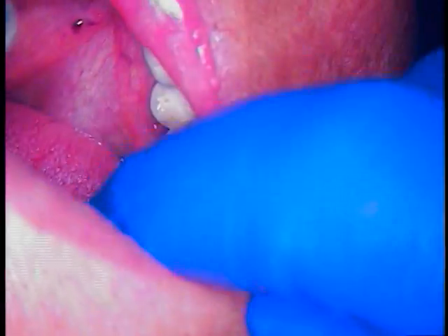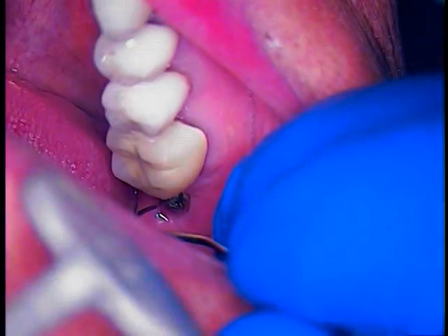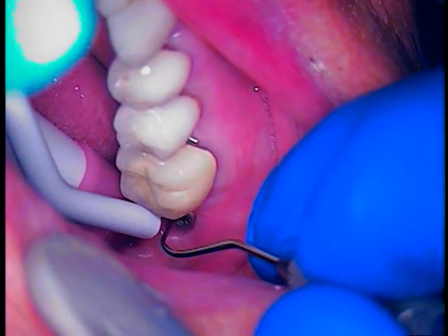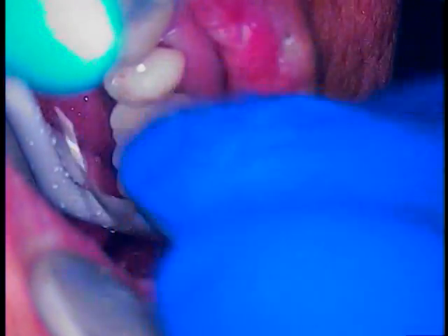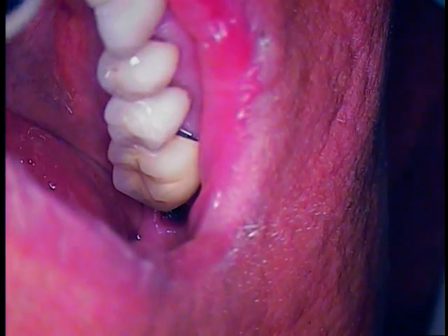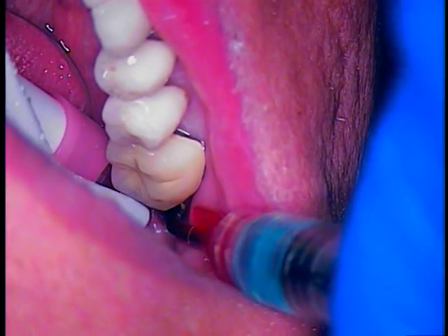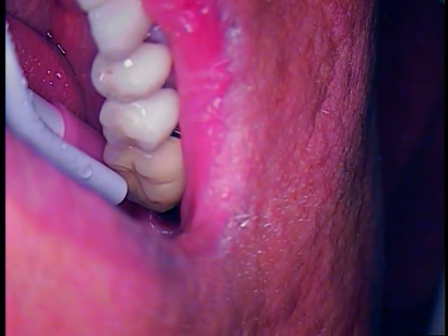Let's have a look. I'm going to put him in a little better position, using plenty of arm support and wrist support when using a microscope. First I'm going to use a long explorer, go inside, and clean that out. Then we'll rinse. This is chlorhexidine gluconate — cavity cleanser soak — she's rinsing that out and then drying.